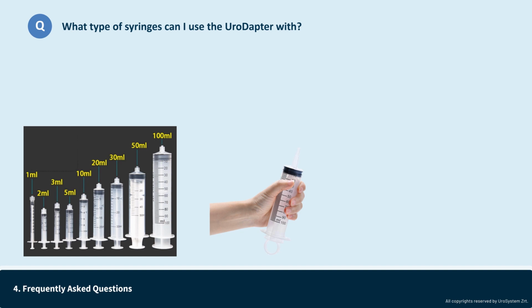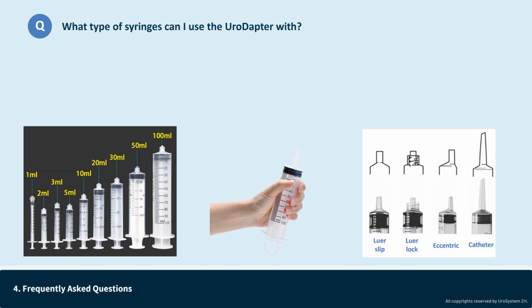The second important parameter is the type of the tip. Most syringes have Luer slip or Luer lock tips, which are compatible with standard needles. With Luer slips, the needle can be attached to the syringe simply by pushing or slipping it onto the syringe tip. With Luer locks, the needle's base end must be twisted onto the syringe tip. Luer locks, for example, are used in intravenous cannulas to ensure better stability and a secure connection to the connecting tubes.